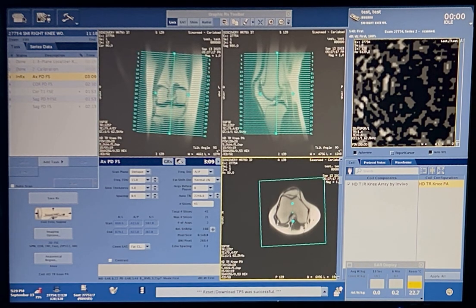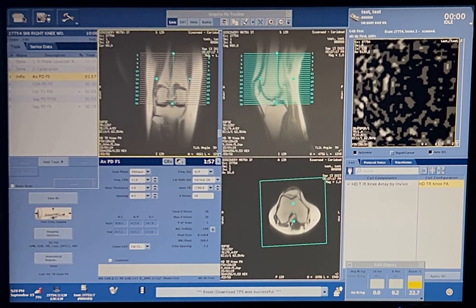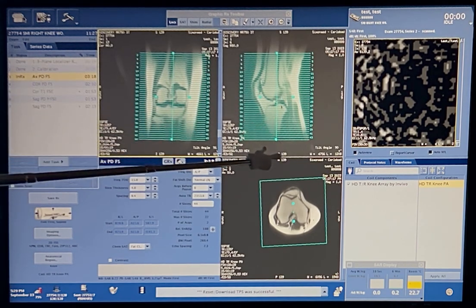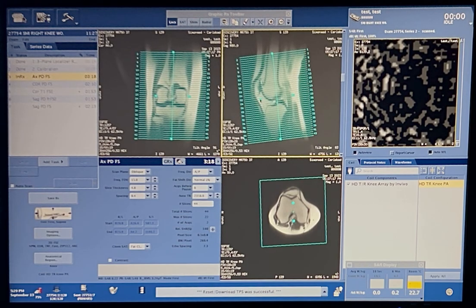Perfect. And you know what to angle with in this plane and that plane? Yes. The structures we were trying to find in the money slices. So yeah, tibial plateau there. There you go. And then let's do the tibia here. Obviously, a little hard to see, but yeah, just use your judgment. Alright, we'll rock that, why not?